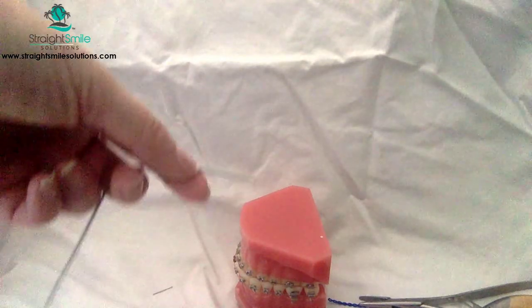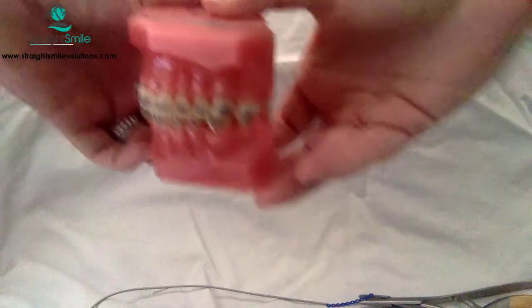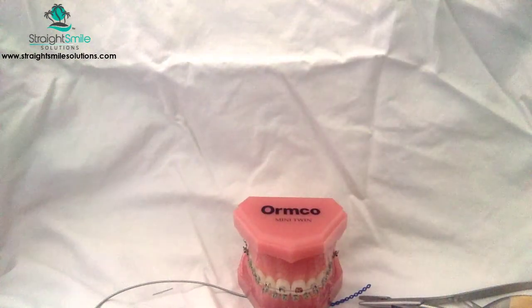Don't forget, you're going to send 5 pictures of each exercise: front, side, side, max, and mand. All right, thanks so much. Again, this was the module for closed coil spring and cinch back sectional wires.